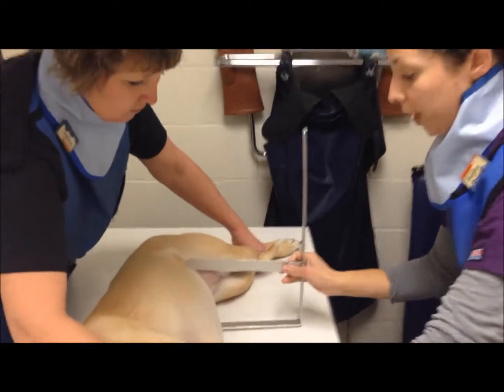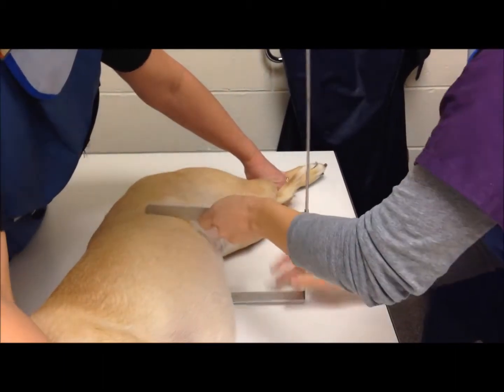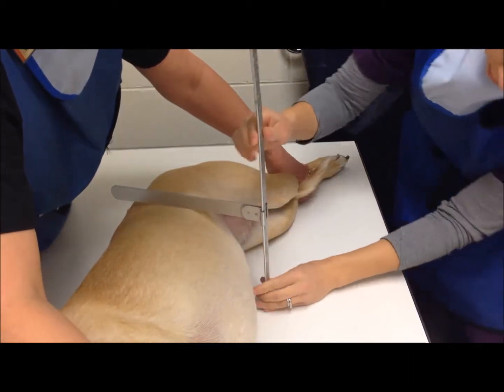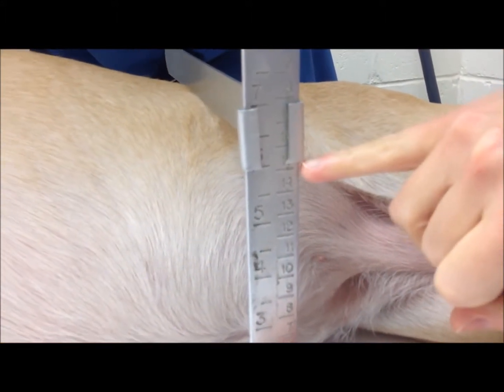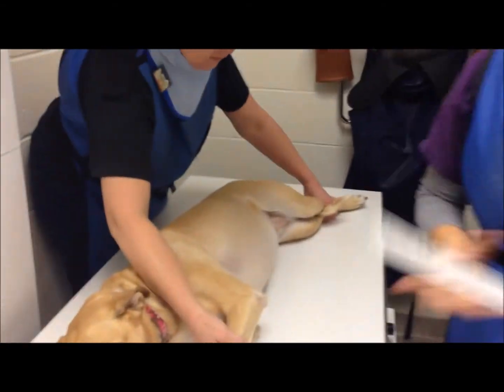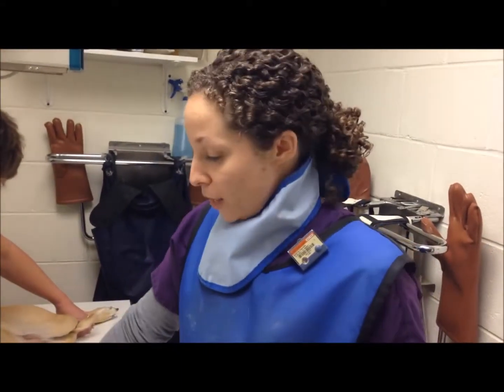And for this, you want to get a measurement that's roughly at the level of the liver. So we've got our calipers open. And as you can see here, she's at roughly 15, maybe a little bit less. But she's a pretty good size. So after this, we'll go ahead and take our x-ray and then we'll check back in.